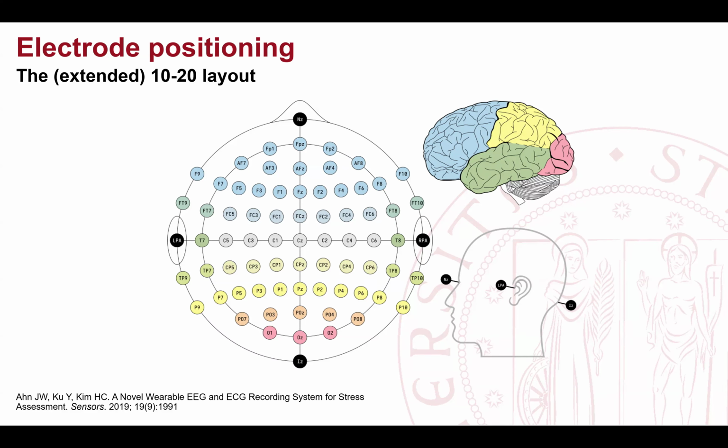Normally, for example, for the GTEC, which are the ones that we know best, the ground is FCZ. It's a useless electrode, so normally we place the ground there, and the reference is on the earlobe. For Antneuro, the ground is still in FCZ and the reference is in CPZ by default, but it can be changed. In other systems, I don't know.